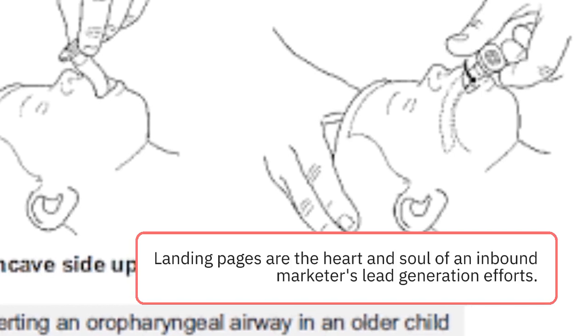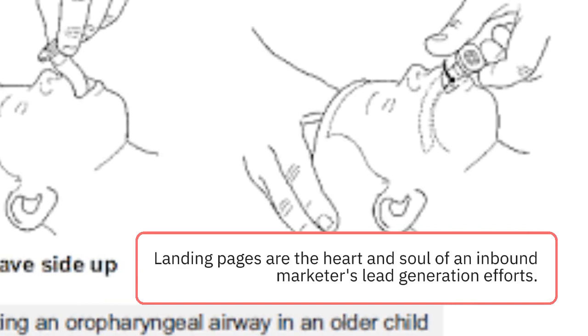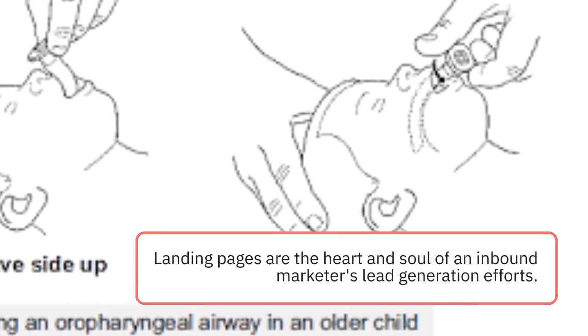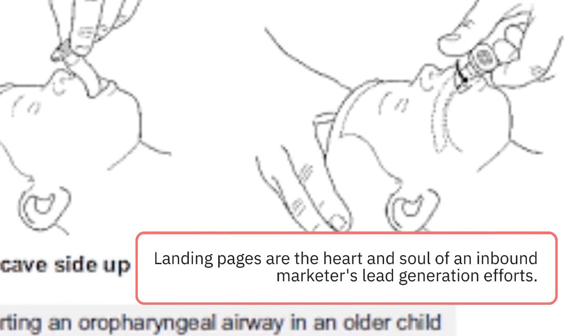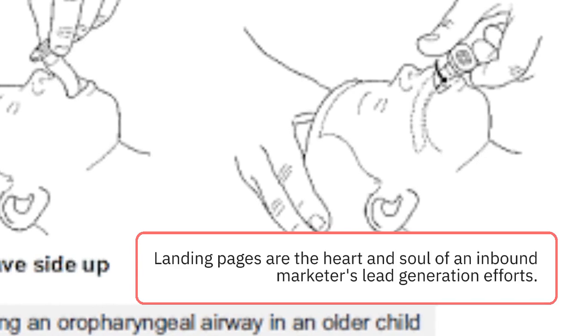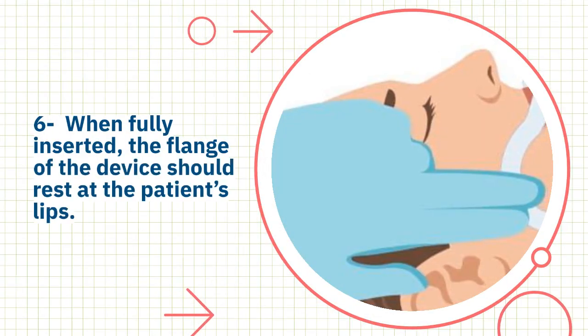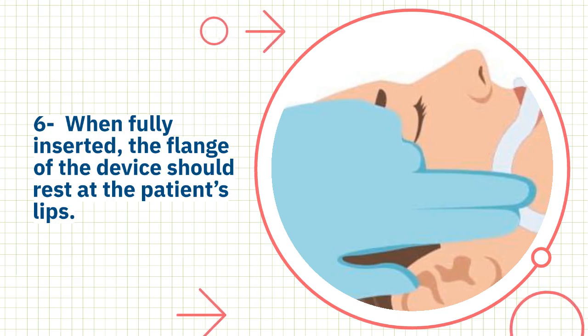Step-by-step description of oropharyngeal airway procedure. 1. As necessary, clear the oropharynx of obstructing secretions, vomitus, or foreign material. 2. Determine the appropriate size of the oropharyngeal airway. Hold the airway beside the patient's cheek with the flange at the corner of the mouth. The tip of an appropriately sized airway should just reach the angle of the mandibular ramus.